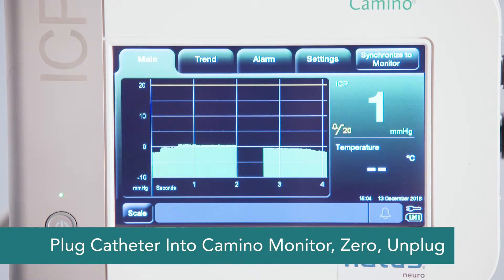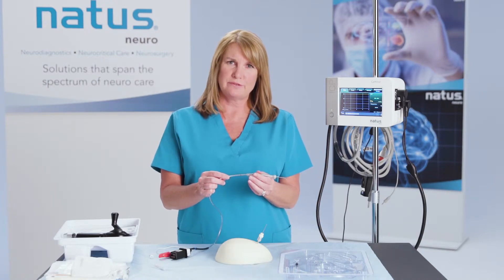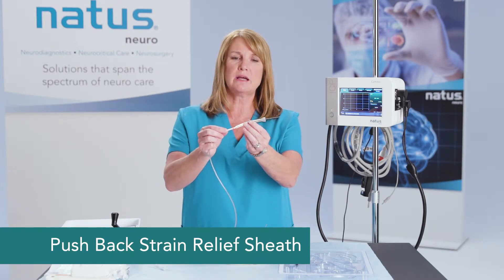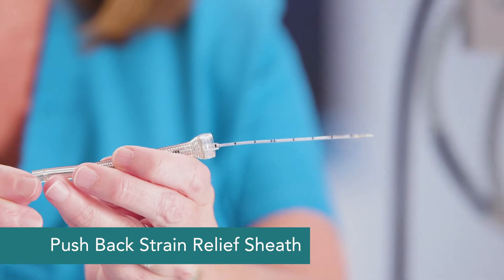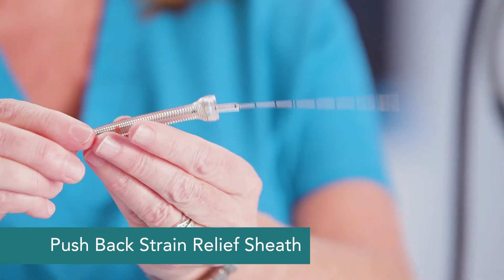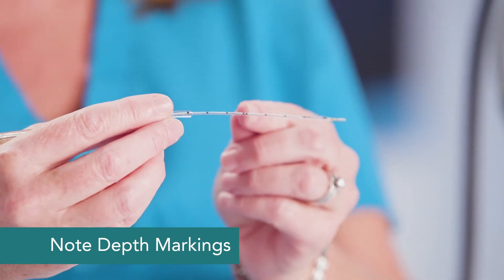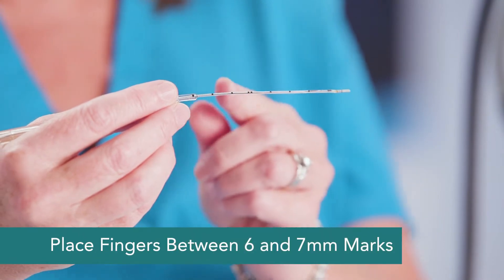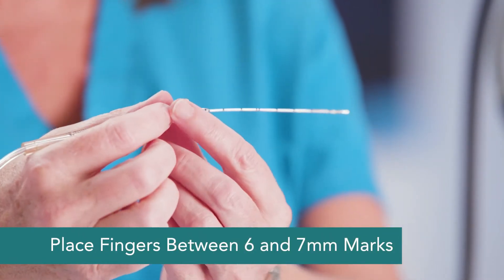Once your catheter is zeroed, we want to go ahead and place it. After zeroing the 110-4BT fiber optic catheter, you'll want to slide the strain relief sheath back so that you can clearly see the markings on the catheter. You can see here where the double line is — that's the five centimeter mark. Where we really want to put our fingers is between the six and seven centimeter mark.